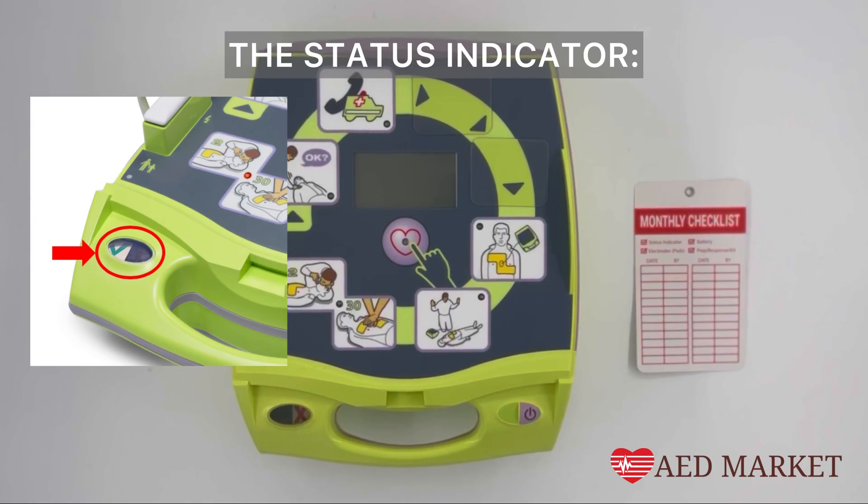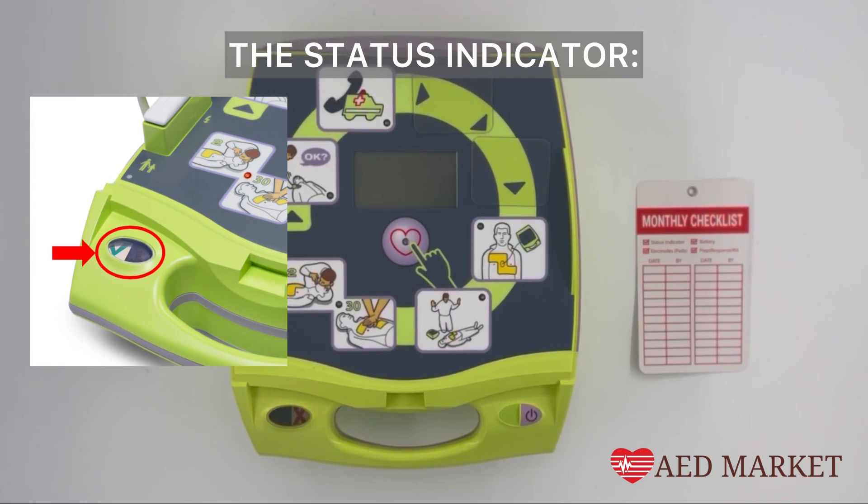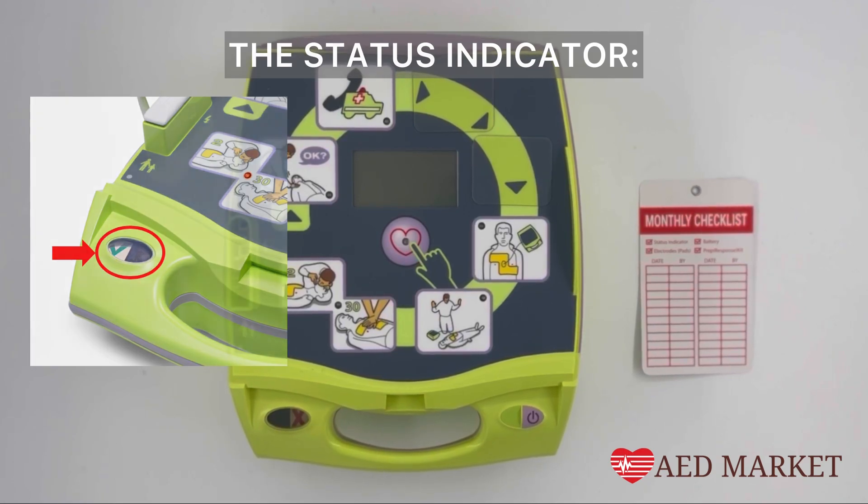The status indicator window, located on the front panel next to the on and off button, provides this vital information at a glance.